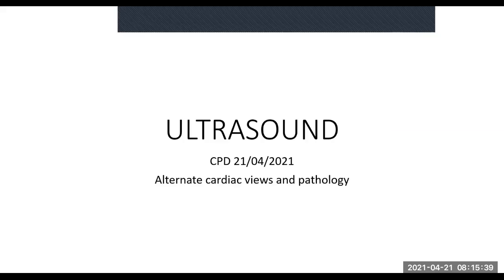All right, so I don't think anybody will have difficulty seeing it today.